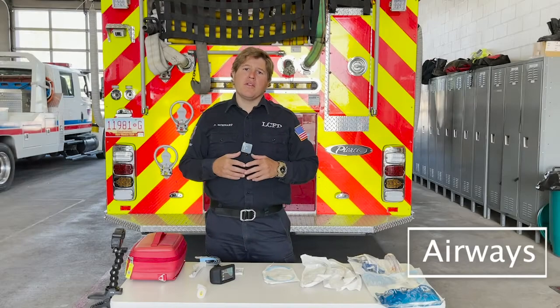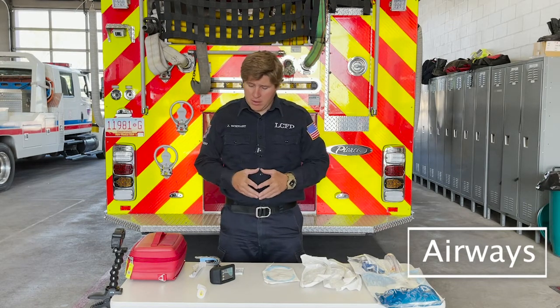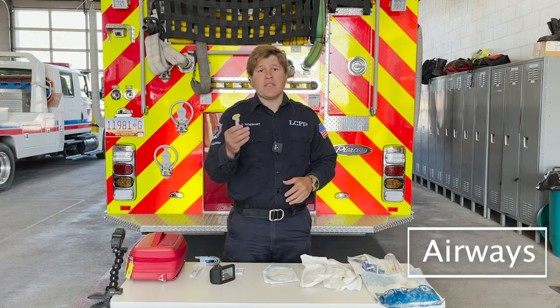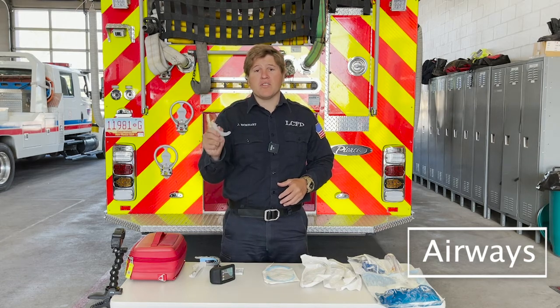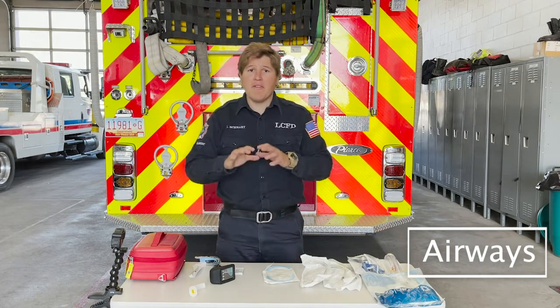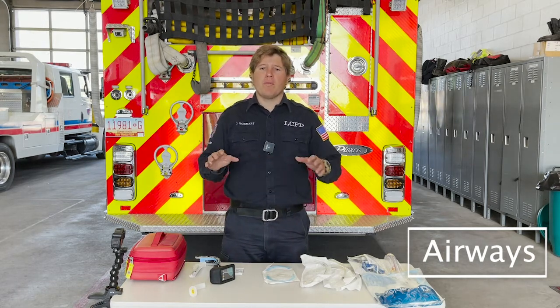All right, now the last letter of the acronym SODA, Airways. Really the meat and potato of what we're talking about today is having your airways ready to go. It might be initially as far as placing that OPA, just so that way we can provide BVM ventilations or for that non-rebreather, but getting everything ready to go before you even perform that.